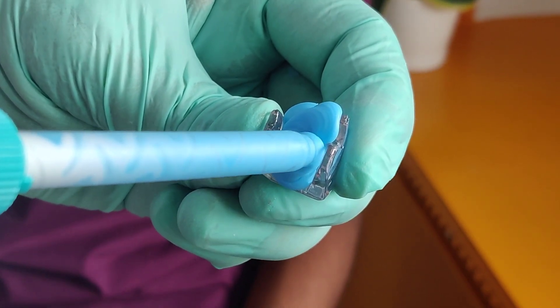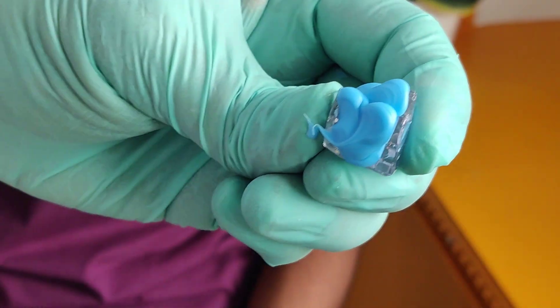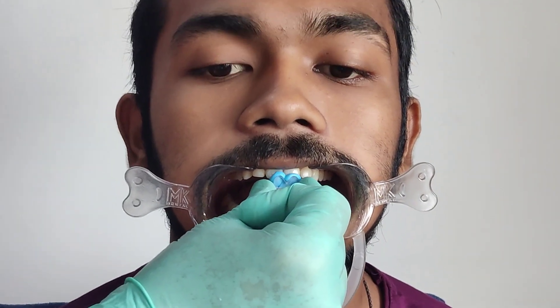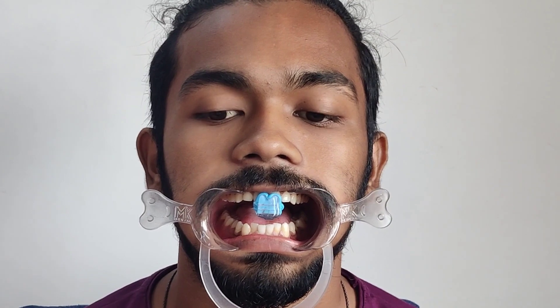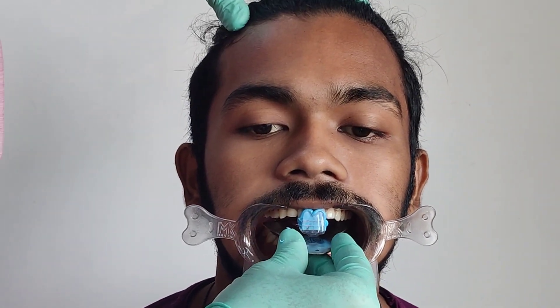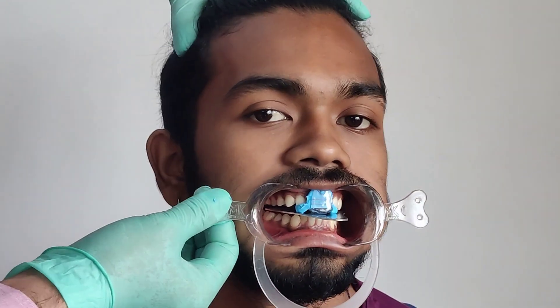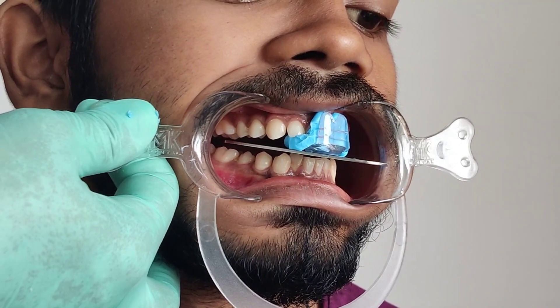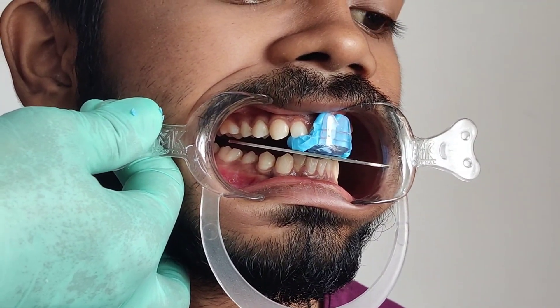Make sure you dispense enough to cover the entire internal surface. Take this into the patient's mouth — open — do not press down. I have placed it only partially in. I now take the DT aligner, position it, and then ask the patient to bite down all the way. As the patient bites down, you will be able to recognize that the DT aligner automatically aligns the Unwind to the maxillary occlusal plane.